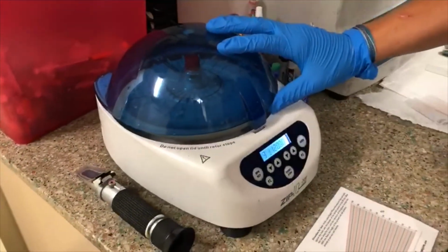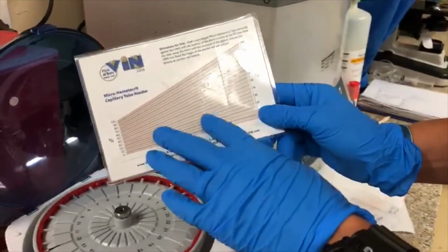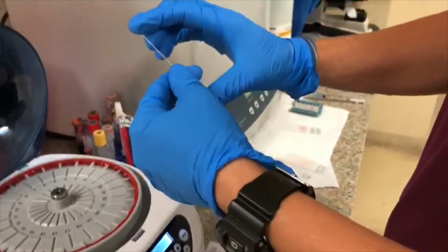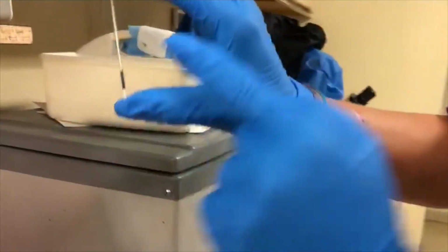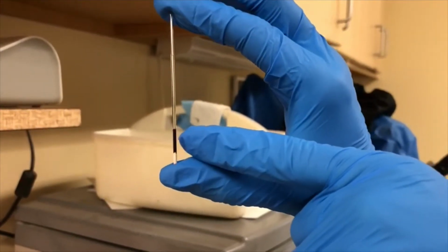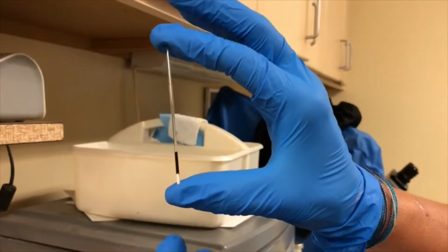So our hematocrits are done spinning, so we're going to go ahead and read them. You don't need very many things. You need the card to read the PCV, packed cell volume, and you need a refractometer. So just these two things will give us a lot of information. And Missy, again, a hematocrit tube is a blood reading, correct? Exactly. So this is our little blood reading here. I don't know if you can see, but this is the liquid portion of the blood. And there is a little buffy layer here, which is the white blood cells and platelets. And then these are the red blood cells packed down at the bottom. That's why it's packed cell volume. All the cells are pushed down to the bottom of the clay, depending on their density.